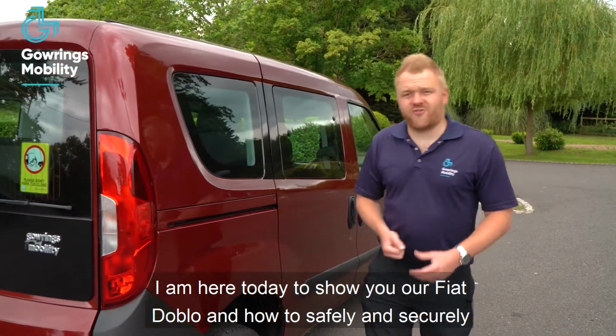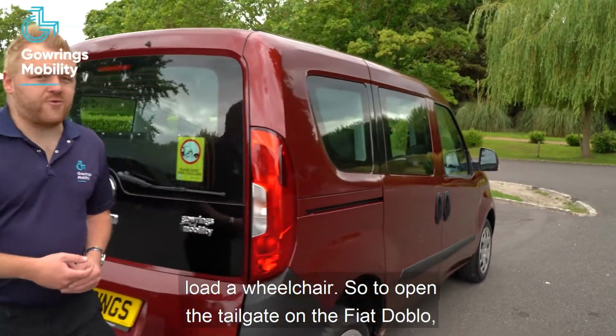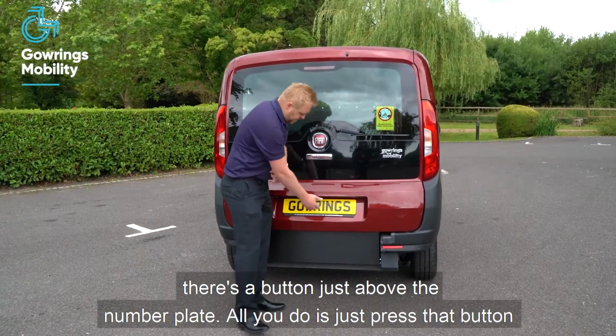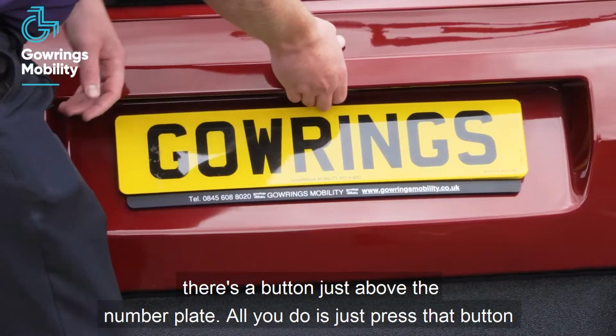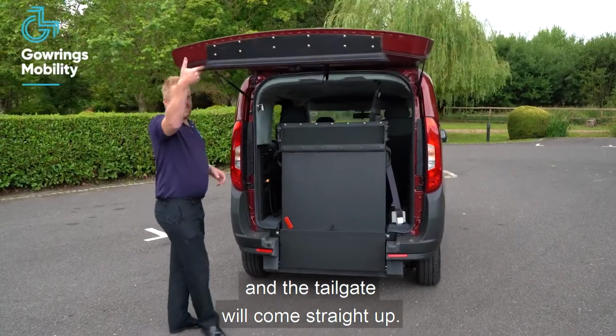I am here today to show you our Fiat Doblo and how to safely, securely load a wheelchair. So, to open the tailgate on the Fiat Doblo, there's a button just above the number plate. You just press that, and the tailgate will come straight up.